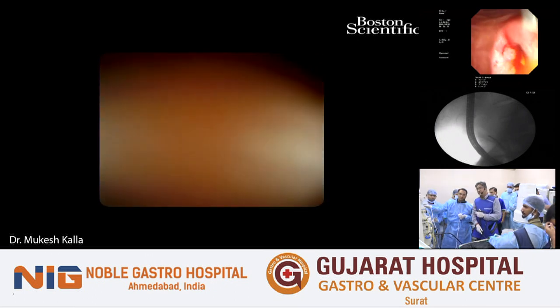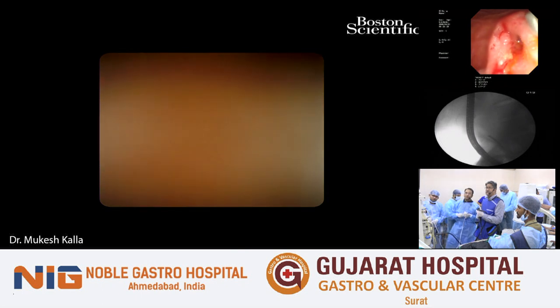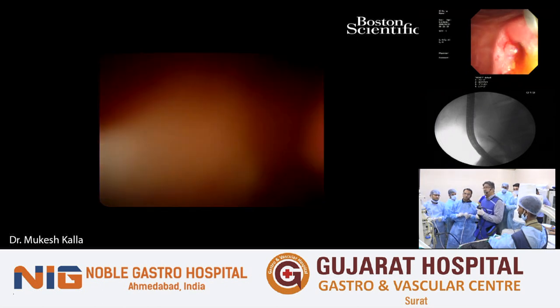So spy basket, in my opinion, is more useful while retrieving an old stent which has migrated in. It can be of use there, but the best use is for cystic duct, of course. Then the second best use is intrahepatic stones. I think we have done it and it's almost clean now.